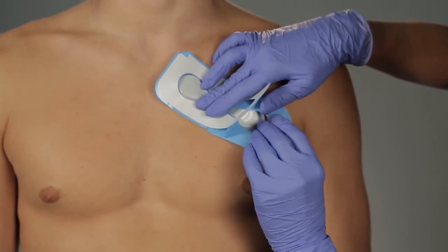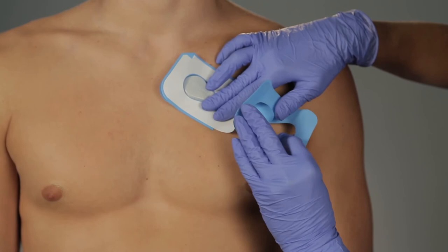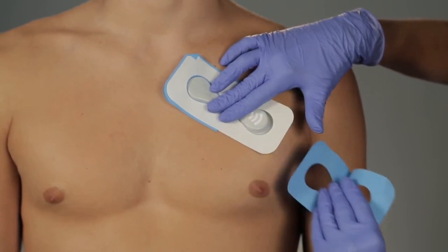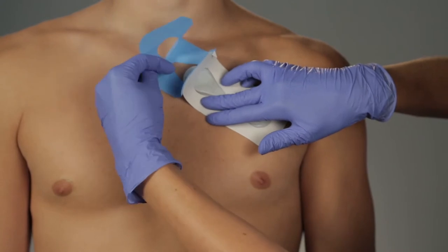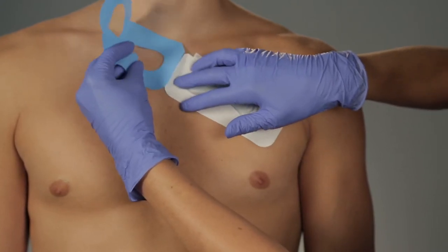Hold down one side, then gently pull the blue tab from under the overlay, pressing down on the adhesive as it meets the skin. Remove the second blue tab in the same manner. Gently press down to adhere to skin.